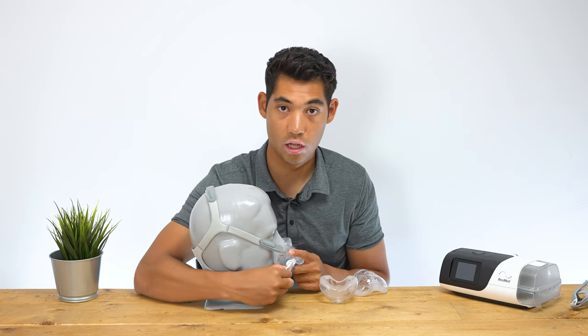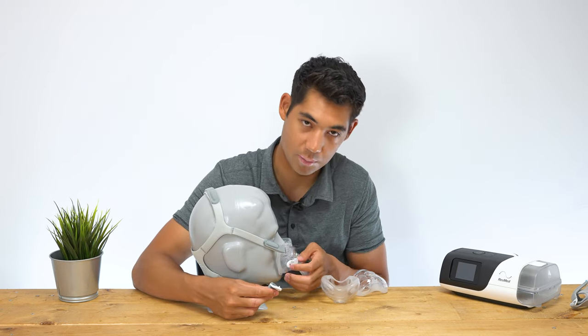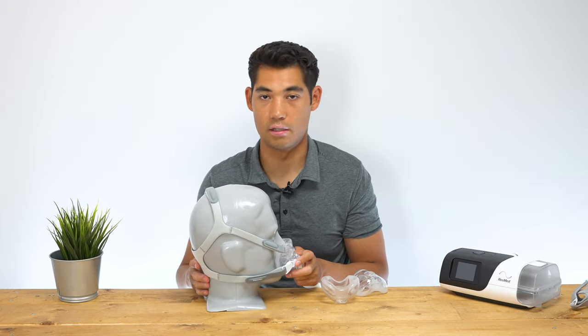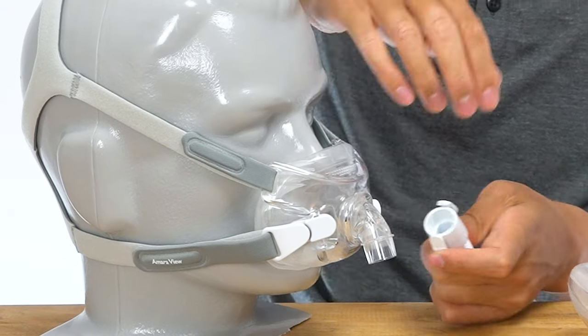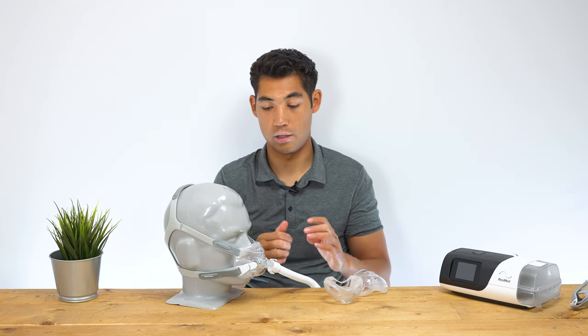Nevertheless, the magnets are a fantastic feature. Older versions of this mask — you might see some older reviews on YouTube — just have a clip you have to tie down. The magnets make it a much more convenient fit. At the front, we have a quick release tube, so you can just pinch that and remove it if you're going to the washroom, then put it back on and re-enter your sleep.